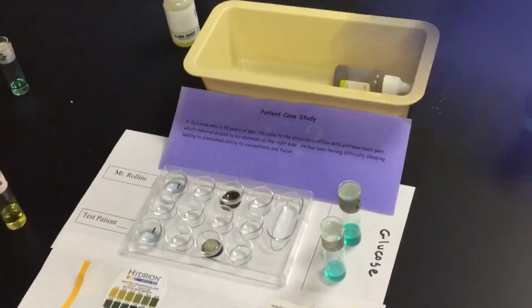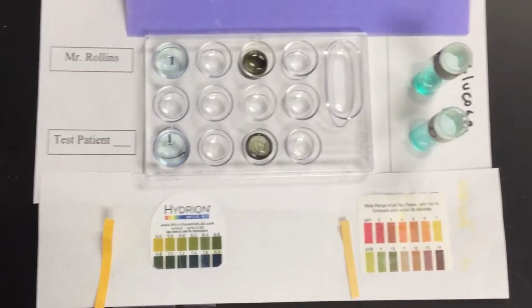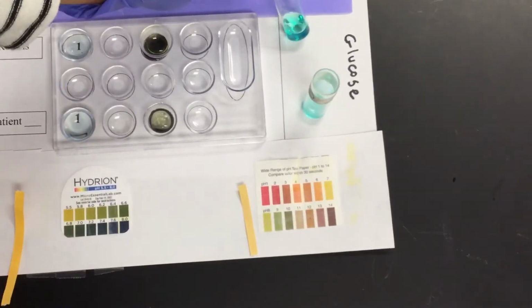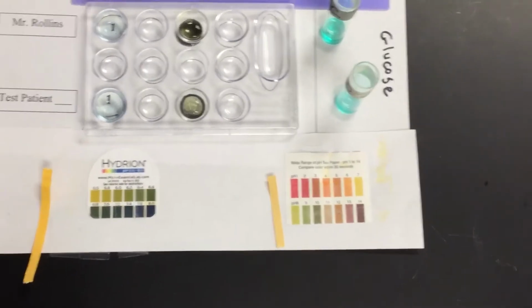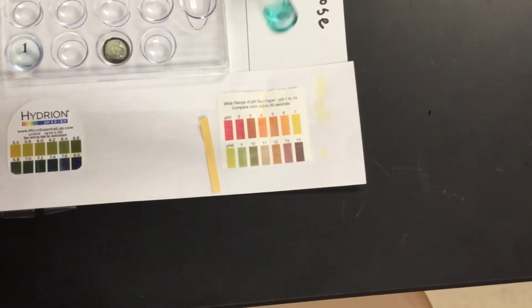A couple things that you are going to be seeing here. I put Rollins's data there for you as well, since he is our control patient, so you can see what his data is going to look like. Along the top is Mr. Rollins' urine. My glucose test is over here. If you remember, Rollins's glucose was negative. That means it was the same colors that it started out with. When we did our test patient, patient number 4, what we noticed about his glucose is that it is the same color as our control patient. So you should be filling in your data chart for that.